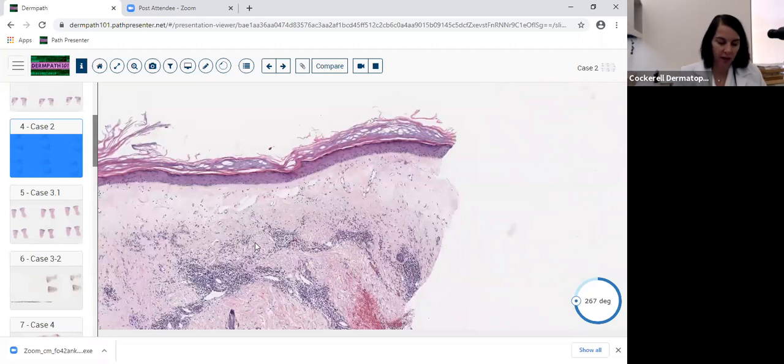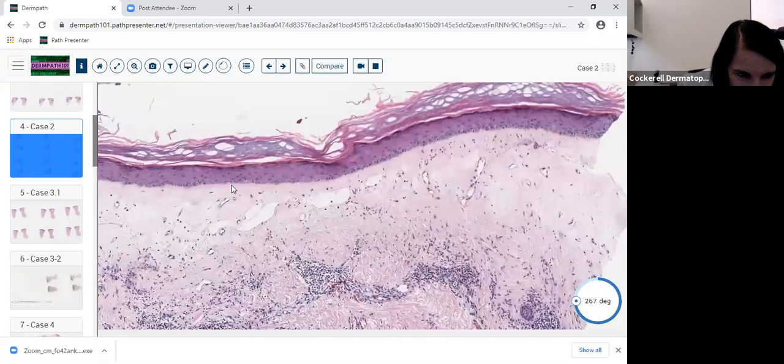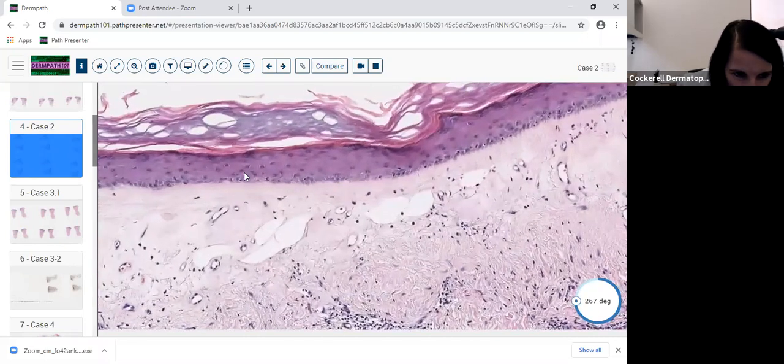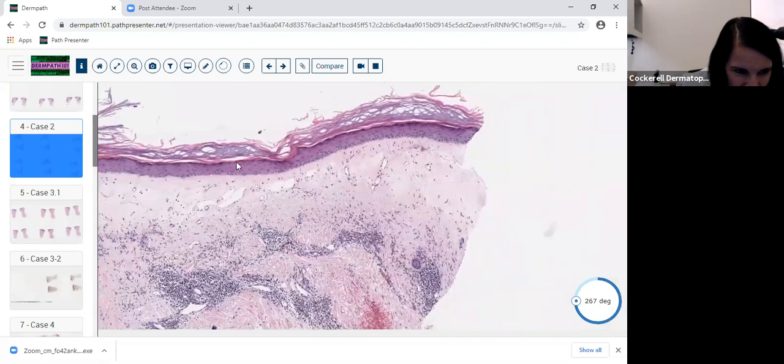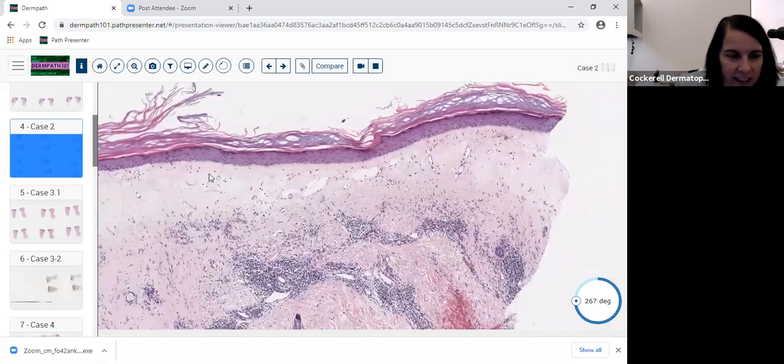So that's pretty much it on this case. We've exhausted it. Just to drill down on the epidermis, it gets atrophic because the basalis layer and the spinosum layer are decreased. And that's why it's atrophic. It actually gets to be thinned. This is not a pre-malignant condition, but it can be seen in association with malignancies.